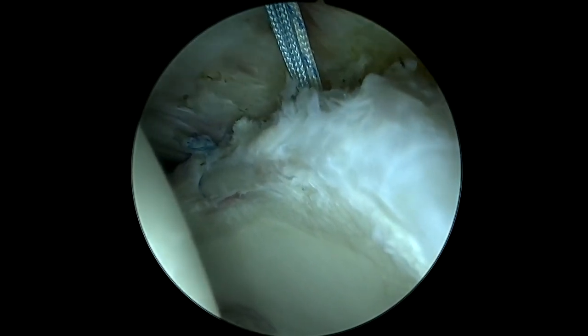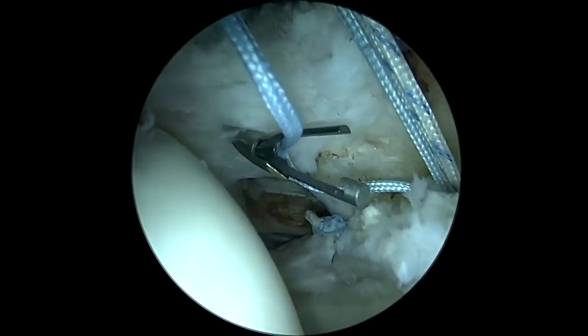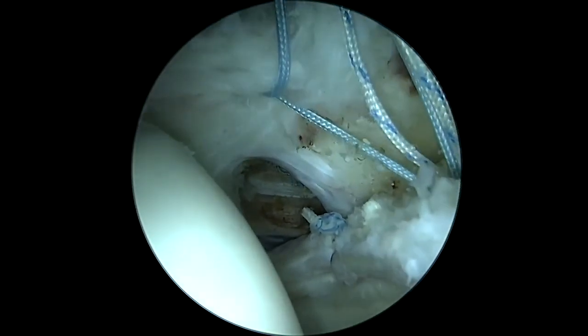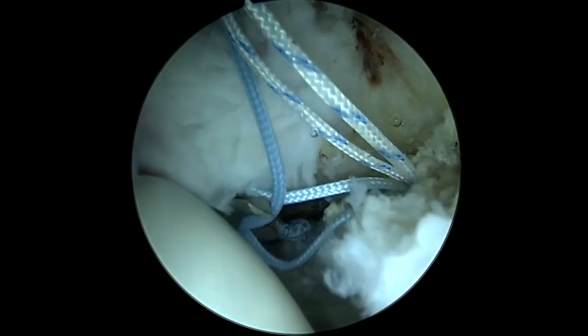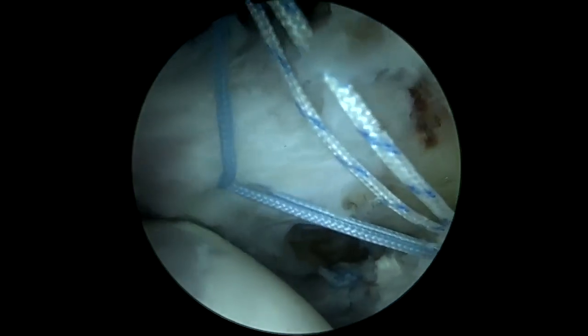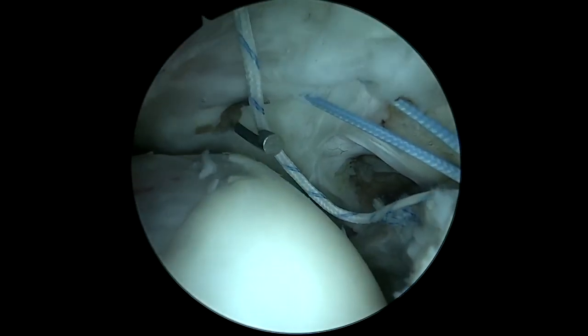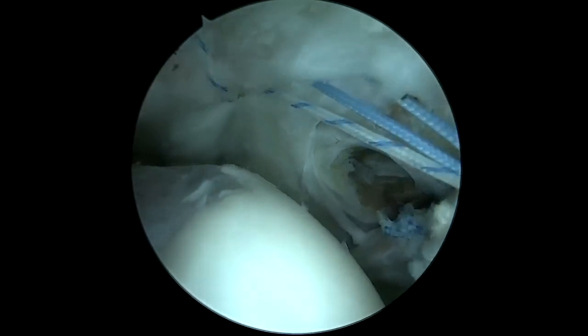distal medial capsule difficult. Following anchor placement, sutures are sequentially passed distally and sequentially lateral to medial along the medial capsular defect using a 70-degree suture passer. Traction is progressively decreased on the operative extremity to allow for safe, increasingly medial instrumentation between the capsule and femoral head. Each passed suture is employed to suspend and further reduce the distal capsular cuff towards the acetabulum. These sutures are then sequentially tied from medial to lateral.